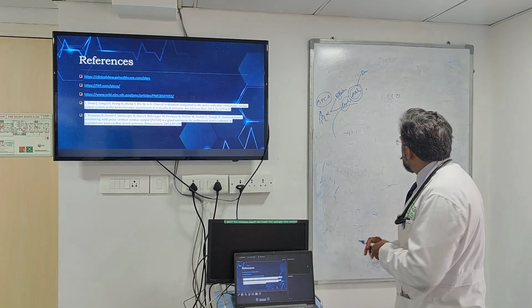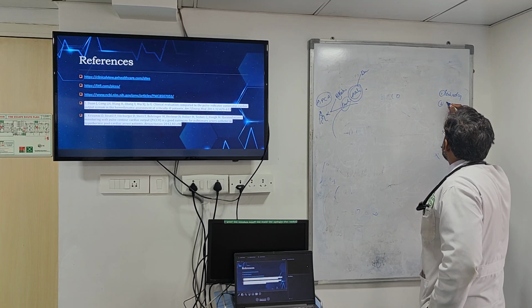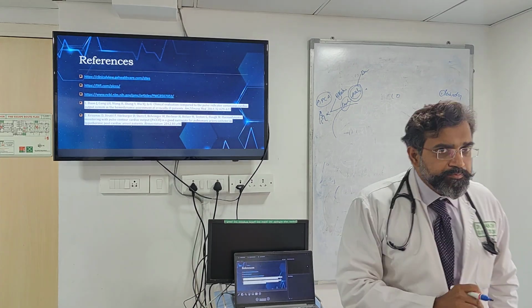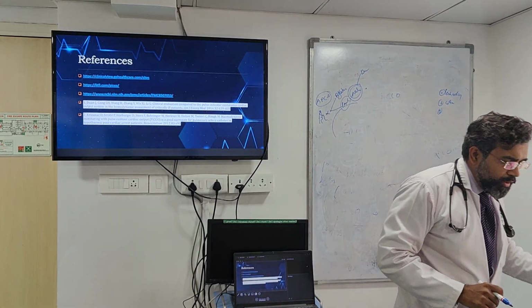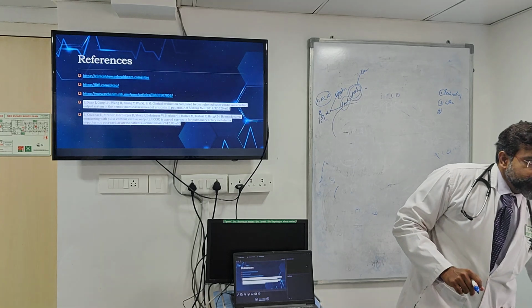Okay. So we now have answered what is the technology, and the second thing is when to do it. Yeah. Question? The calculation of the compliance, as you mentioned, is calculated according to the demography of the patient. It is weight, height. In the APCO.